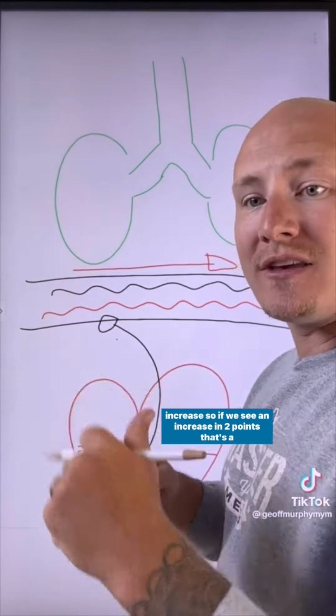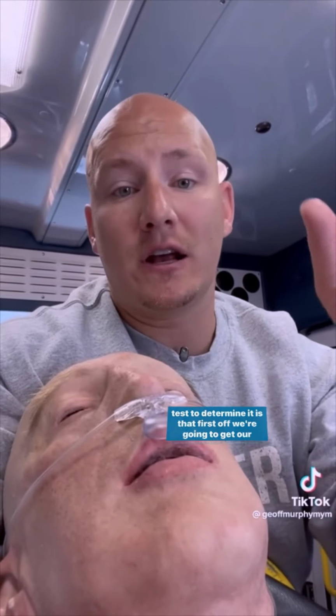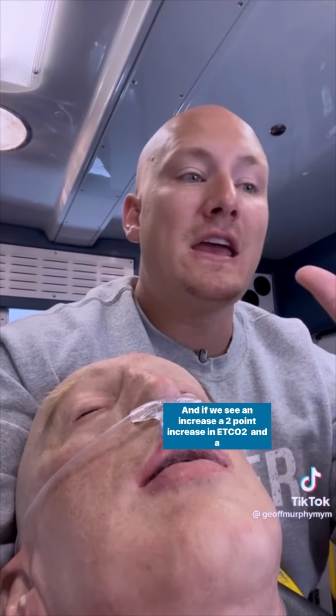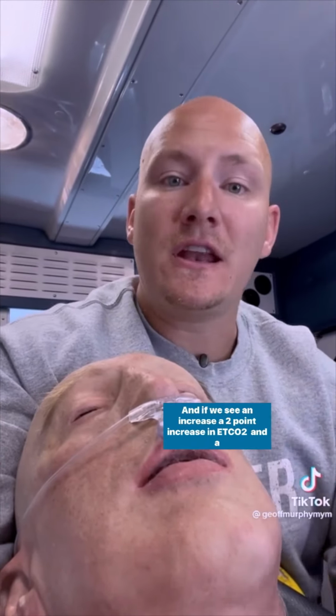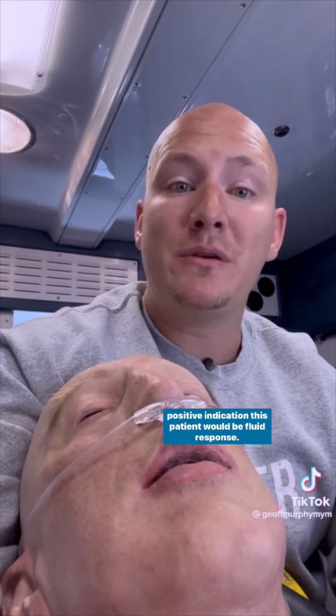Okay, so now that we know the physiology, basically how we do this test to determine it is that first off, we're going to get our patient in a Trendelenburg position. So basically getting the legs up in a passive leg raise is what they call that. We're going to do that for 5 minutes. And if we see an increase, a 2-point increase in end-tidal CO2 and a 10-point increase in systolic blood pressure, that is a positive indication this patient would be fluid responsive.